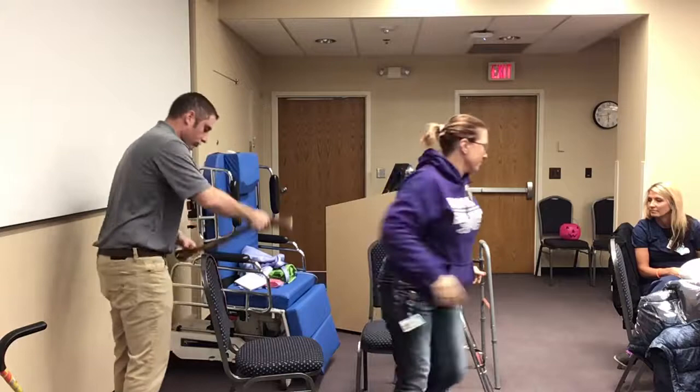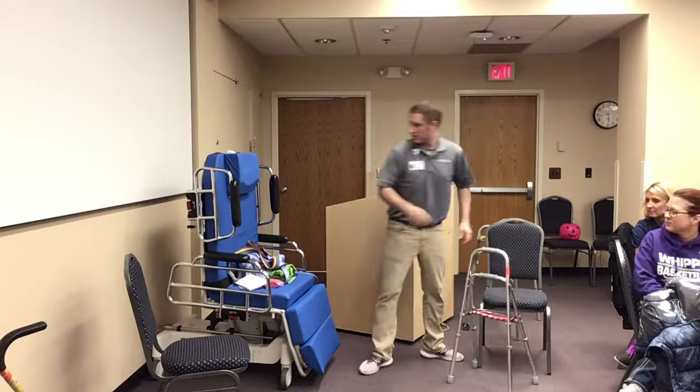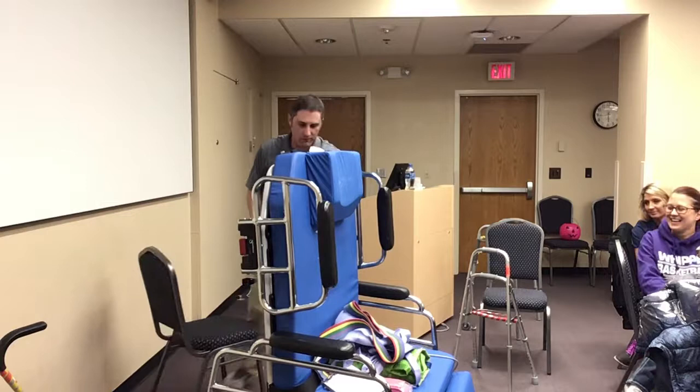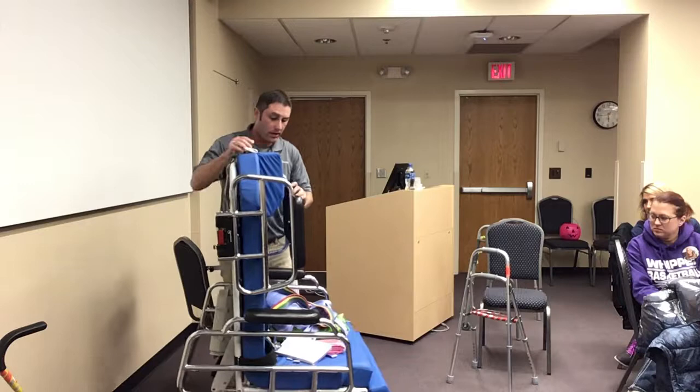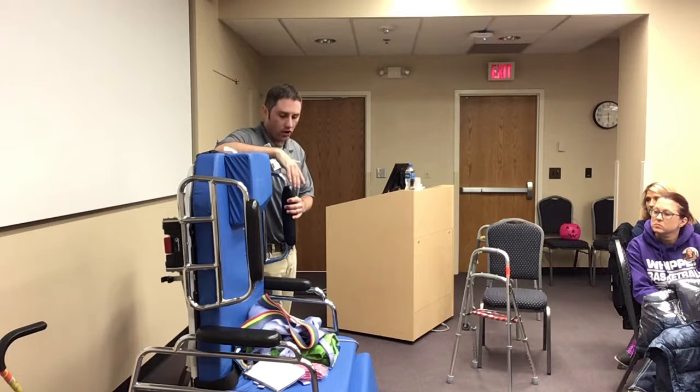Let's talk about the blue neuro chair. Some of you remember the pink Cadillac chairs — these are just like a wider version of that. Really handy for patients who are maybe a little bit impulsive, or patients who have really bad trunk control where you just don't know if they're going to be able to sit in a normal recliner at all. This is a good starter chair for those kinds of patients.